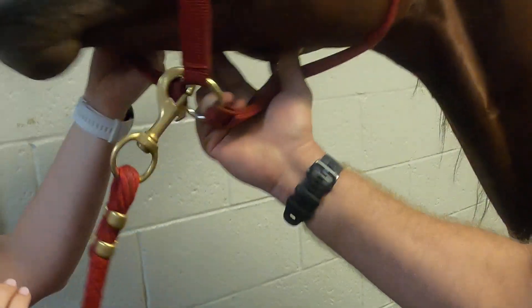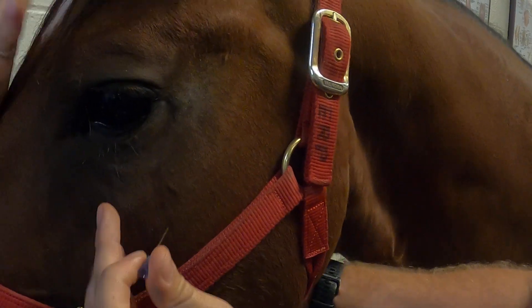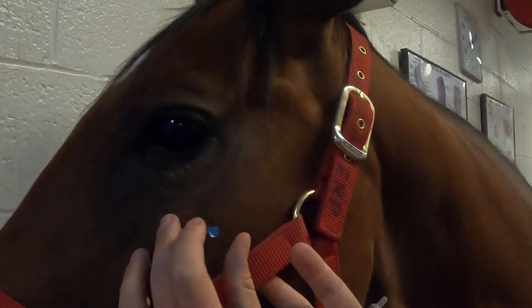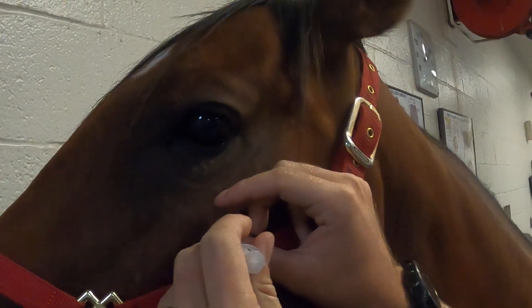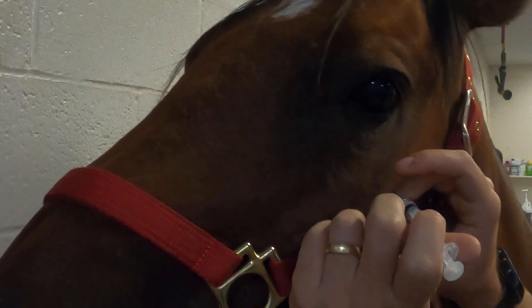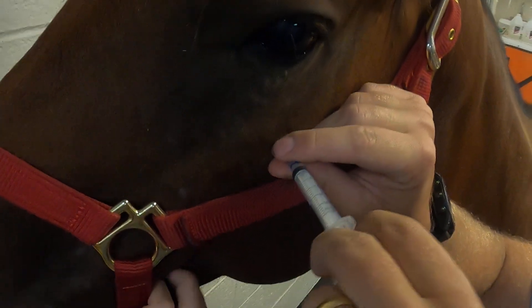Sometimes horses are not going to oblige, so what we can do is distract him a little bit. There we go, we got the needle in. If we can't get it here because of his complacency, then we'll obviously do a more conventional draw from the jugular vein.